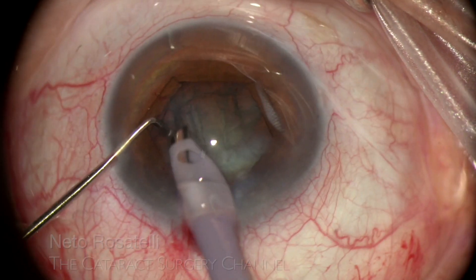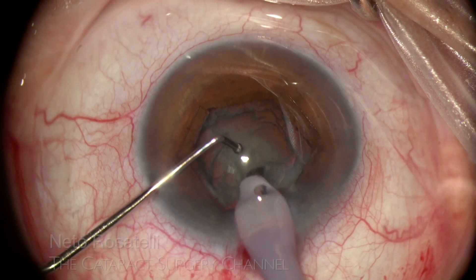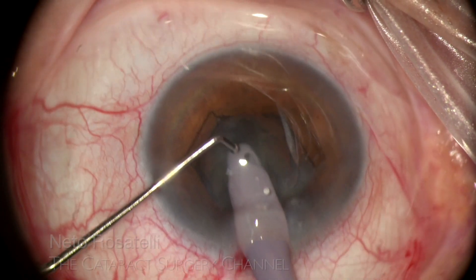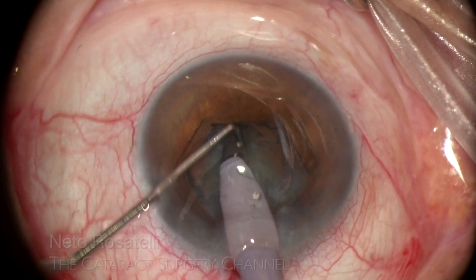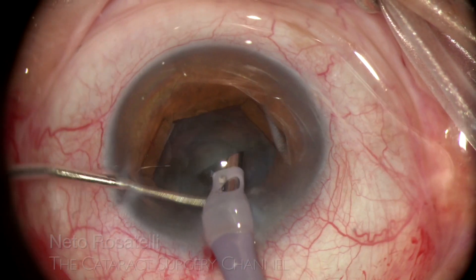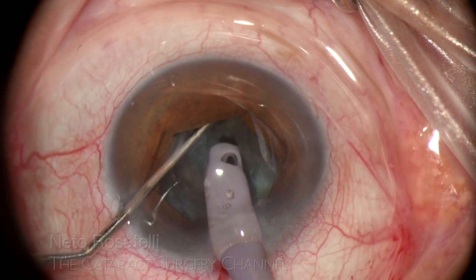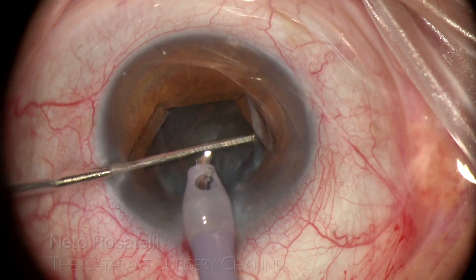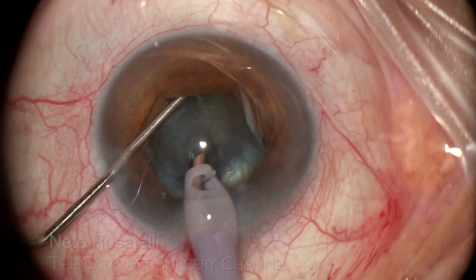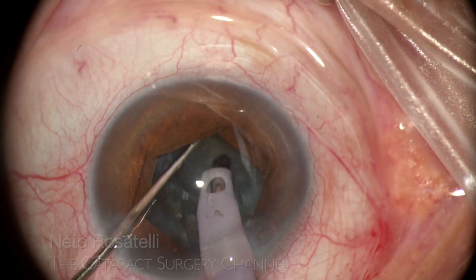Until cortex cleanup is done for better visualization, a deep trench is performed, and I use the trench wall for support to rotate the nucleus. I exercise caution here, for this eye has suffered blunt trauma and zonular compromise may be present. Mechanical fracturing follows, and in instants the nucleus is completely divided for easy emulsification.